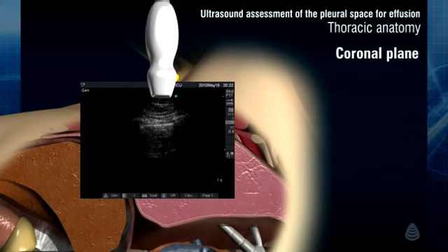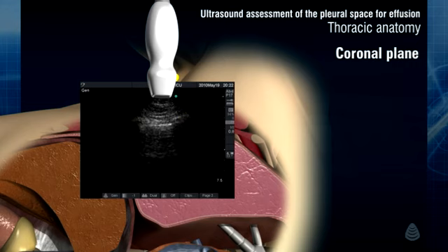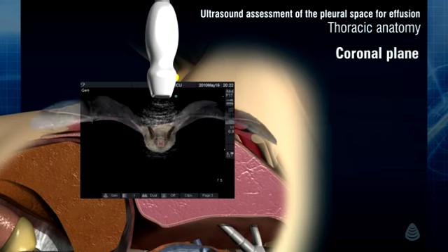Despite not being as sharp as with the vascular probe, imaging of the superficial chest wall structures with the phased array probe will be very adequate. We can here visualize the pleural line, the faint rib shadows with rib artifacts, and the lung sliding. Once again, the bat sign can be appreciated.